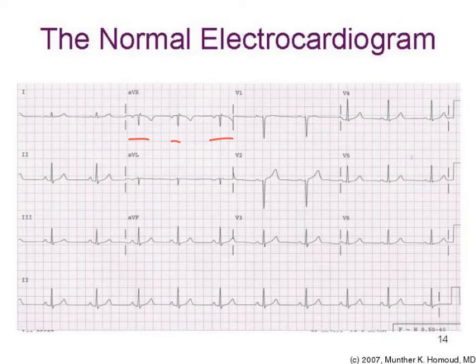But you can see here that if you obtain a 12-lead ECG on a person, you will have all 12 of the leads we mentioned earlier represented, starting from lead 1, lead 2, 3. You'll have the AVR, AVL, AVF, and you get these from the 5-lead ECG we mentioned.